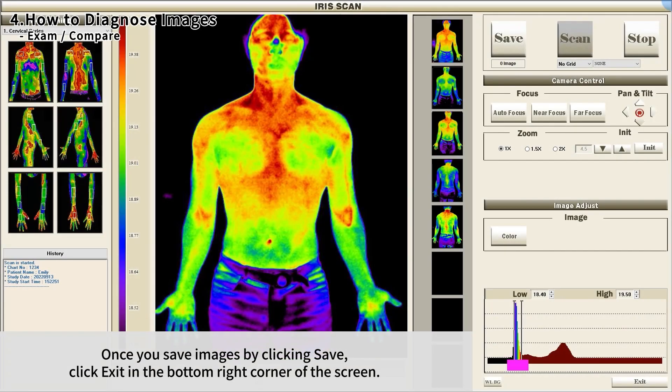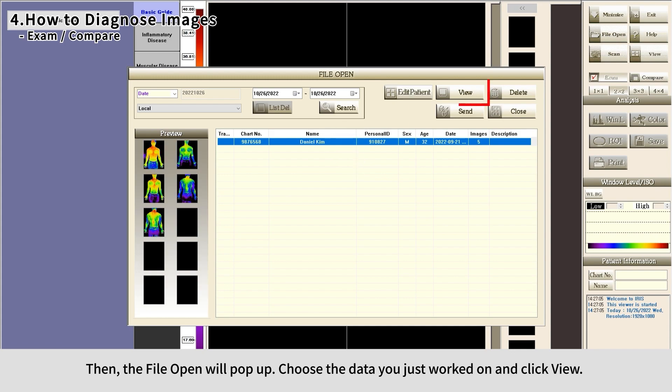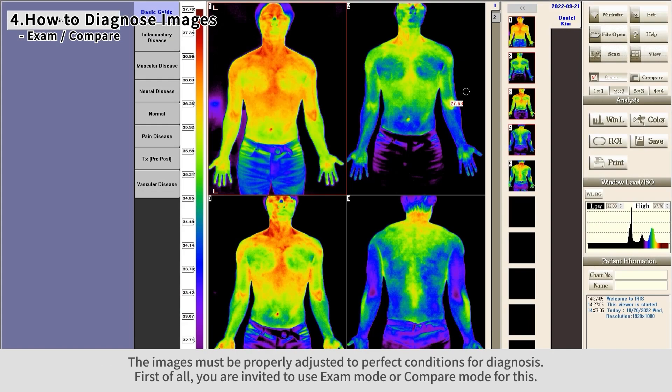Once you save images by clicking Save, click Exit in the bottom right corner of the screen. The File Open window will pop up — choose the data you just worked on and click View. The images must be properly adjusted to perfect conditions for diagnosis.